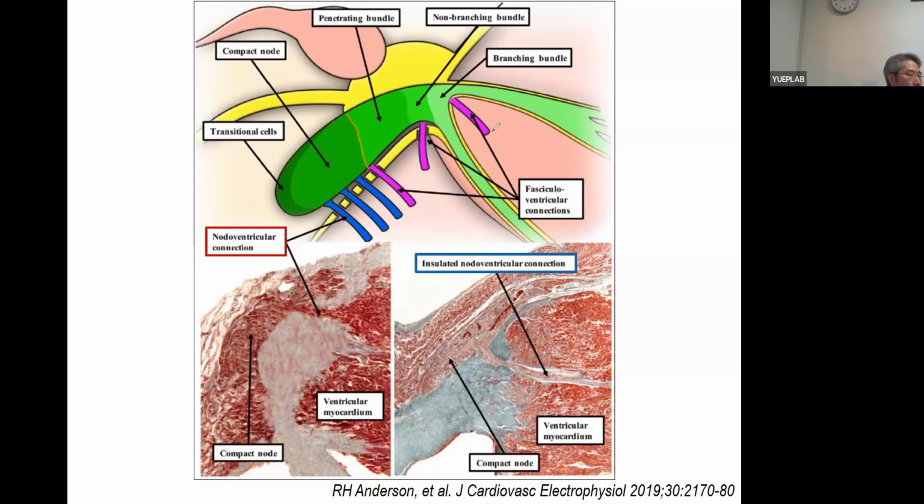So the question is whether to ablate the slow pathway. Obviously if you have AVNRT you ablate, but with a single echo we do not ablate in our series. I don't have that many, probably about 11 or 12 Mahaim in my lifetime so far, and many of them have another conduction, by the way. But I have not had any case that induced AVNRT. A single echo is quite common. I know some other guys did induce dual tachycardia as well. Especially when you have a VA conduction time jump from one to another, back and forth, you can figure that out when the tachycardia cycle suddenly lengthens.